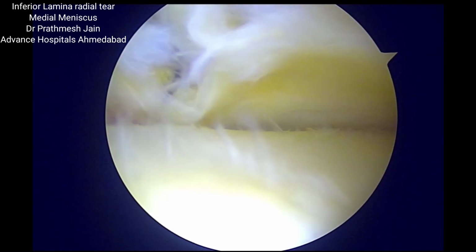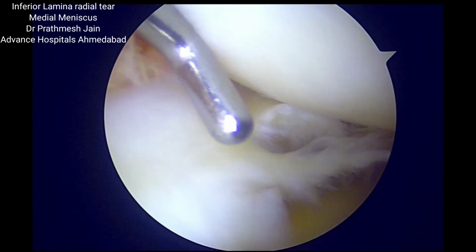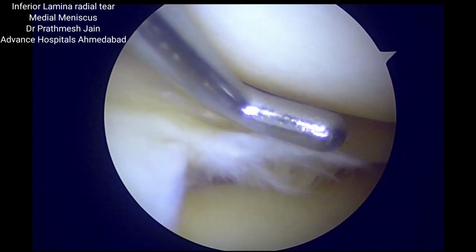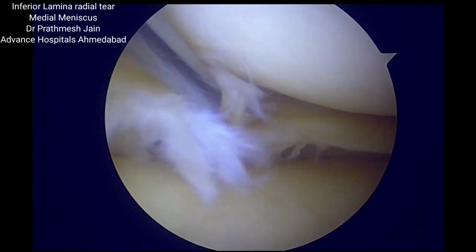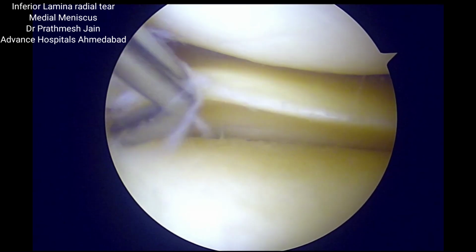So here we can see that there is a radial tear of the inferior lamina of the medial meniscus, thereby leading to a mucoid degeneration kind of a tissue on the inferior surface of the meniscus. So it is important to identify this pattern.